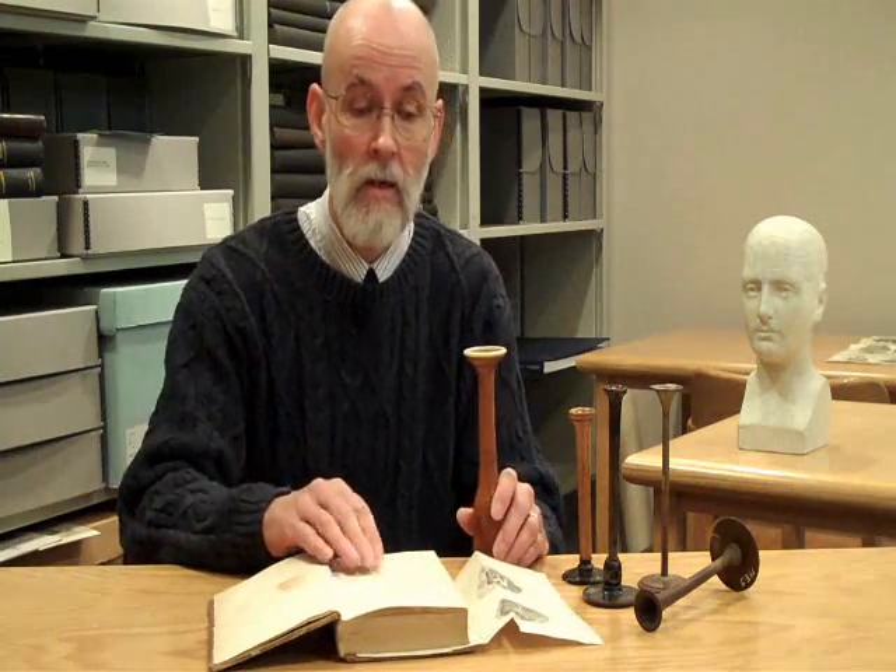The five objects on the table are stethoscopes — monaural stethoscopes. The stethoscope was the invention of René Laënnec, a French physician and well-known authority on thoracic diseases.